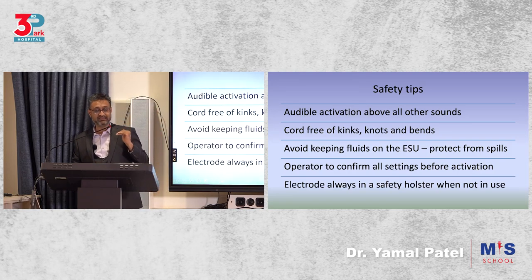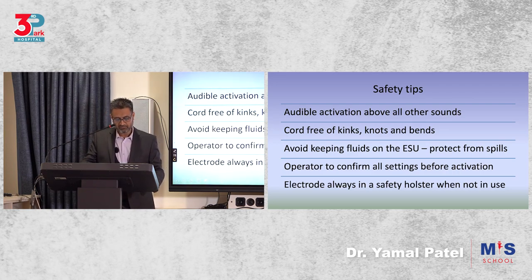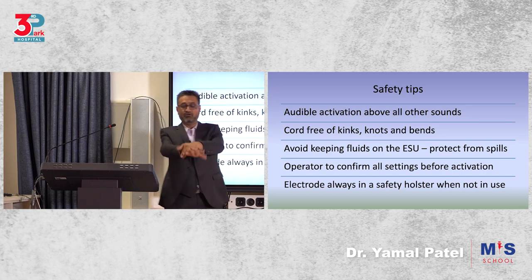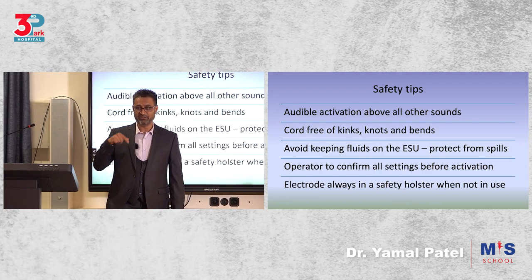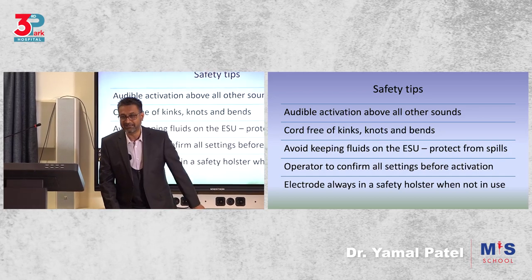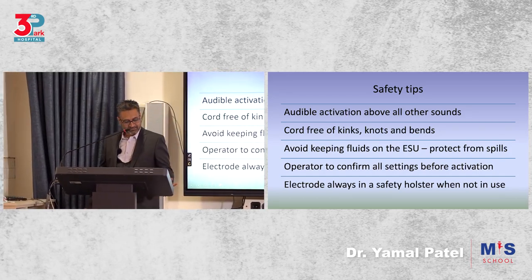The operator must confirm all settings himself or herself before activation. And the electrode should always be kept safely in a holster. Don't put the electrode on the patient's thigh or on top and then keep on working like that. Because when you activate by mistake, if it's a monopolar hook, it will actually burn here without you knowing, for sure. Trust me, that's very dangerous.